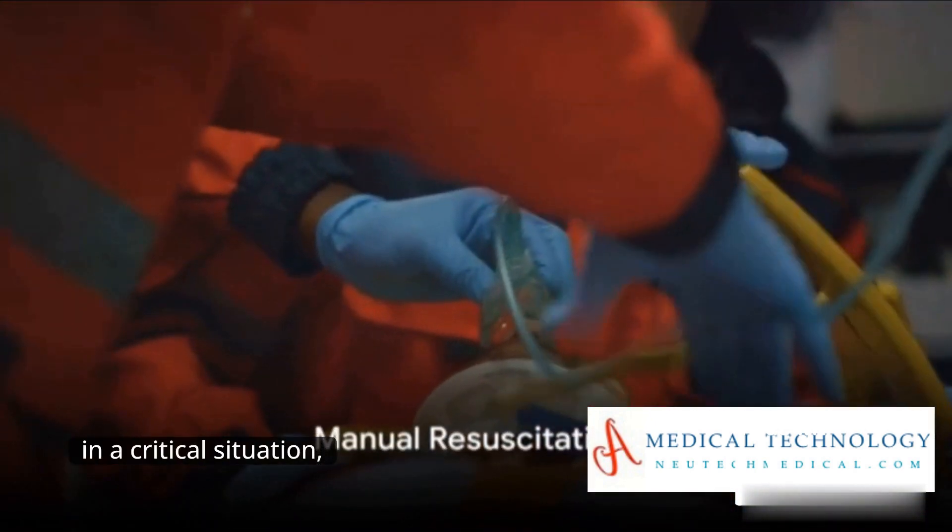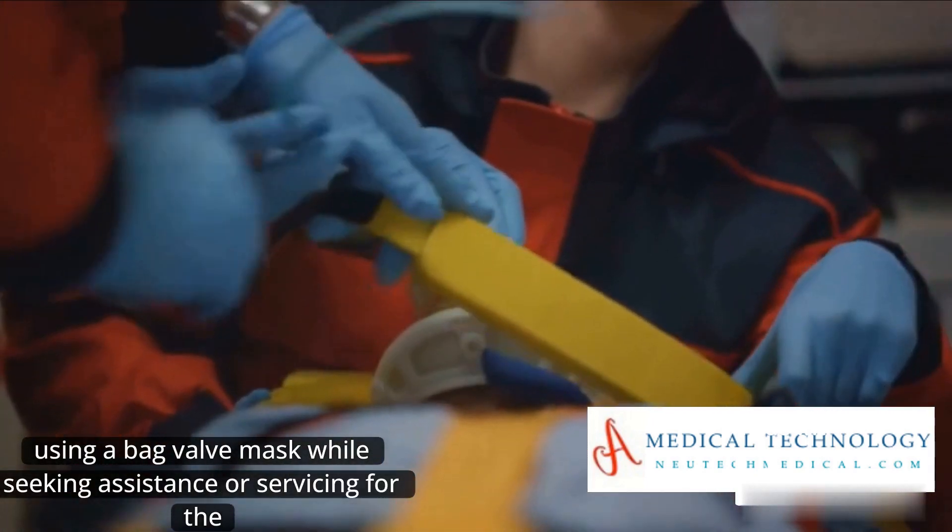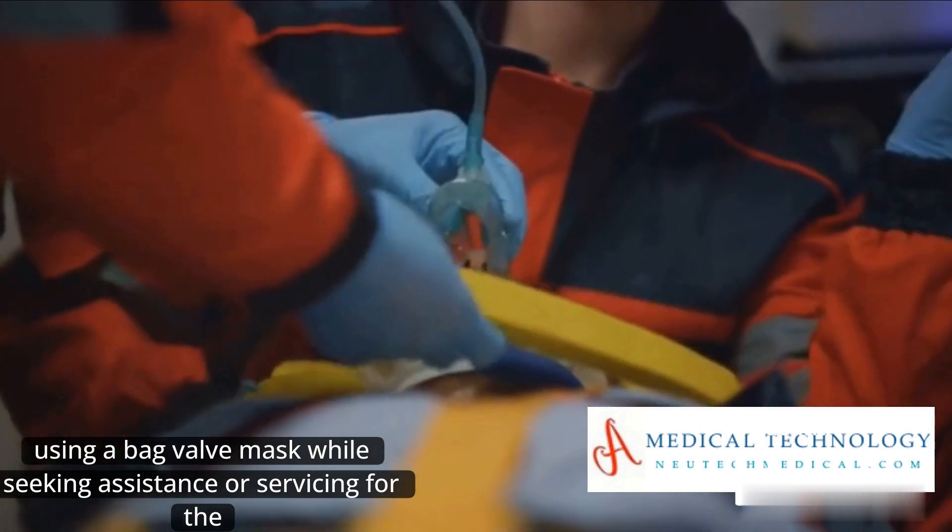And finally, in a critical situation, be prepared to manually ventilate the patient using a bag valve mask while seeking assistance or servicing for the ventilator.